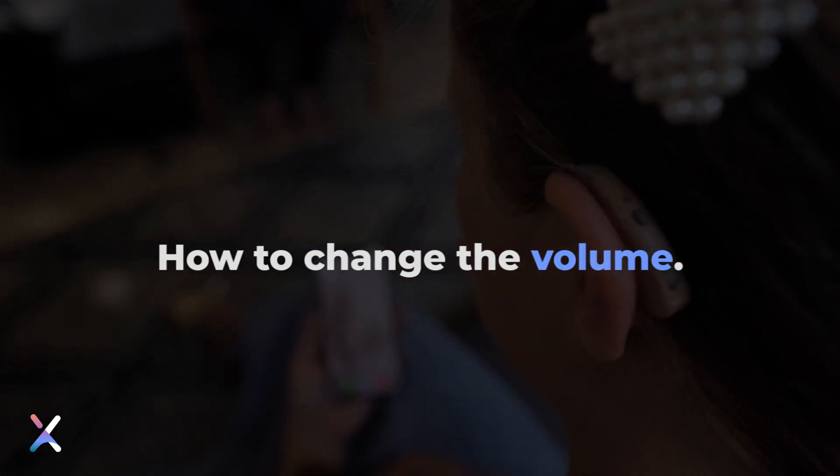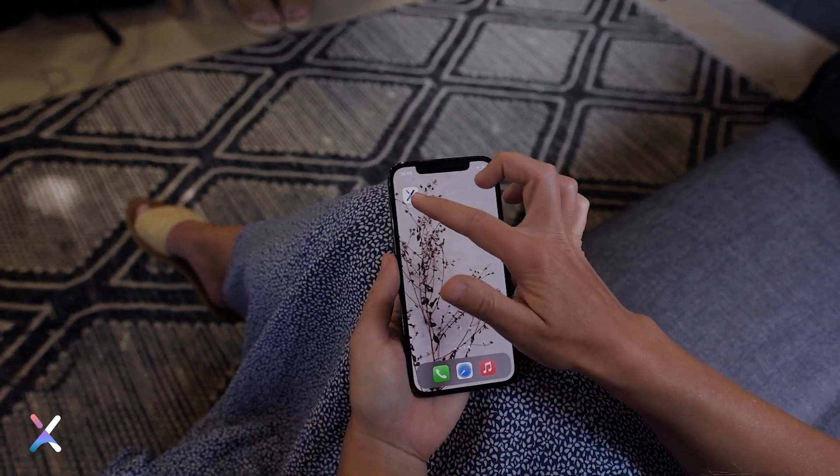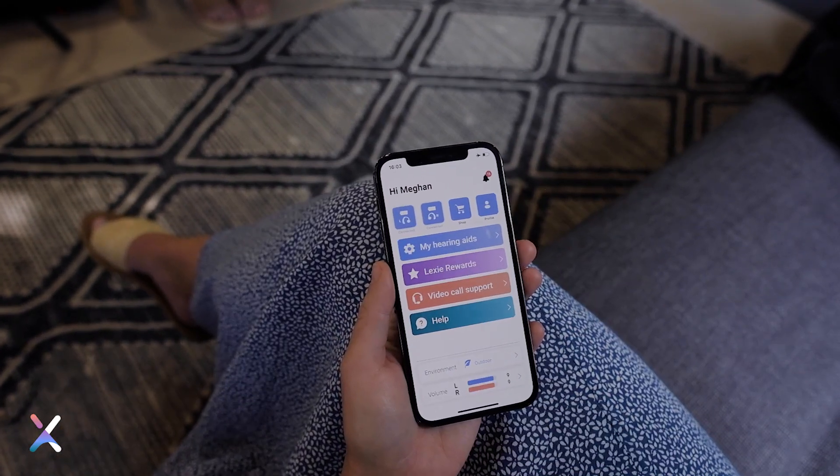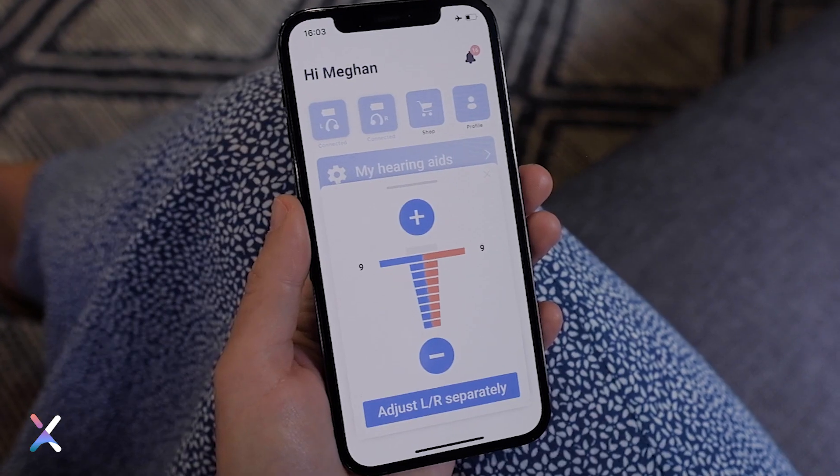How to change the volume on your Lexi app. Open your Lexi app. You will find the volume settings on the home screen. Tap on the volume settings. This will open the volume control.